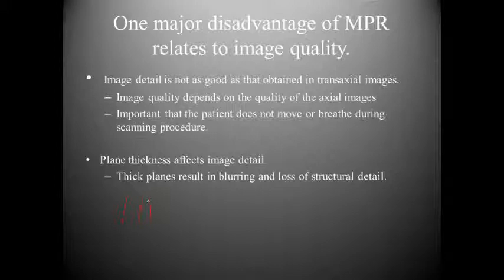Probably in an hour, the ER physician says, I would like some of those 3D reconstructions for this patient. And so I told the ER physician that there is really no way that I can do that because I scanned in a thicker plane because that was our protocol at the time, and there would be no way to actually get good looking MPRs. However, the issue was important enough that the physician recommended that the patient have these images, and so I told the physician that I would have to rescan the patient again just to acquire images that are contiguous so that I can do these images. However, the physician felt that it would be worthwhile for the patient to undergo it, and so I had to scan the patient again.